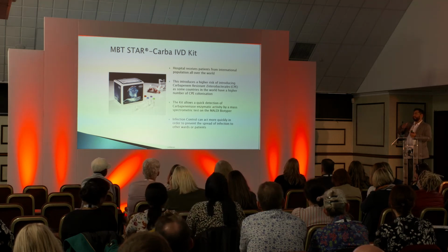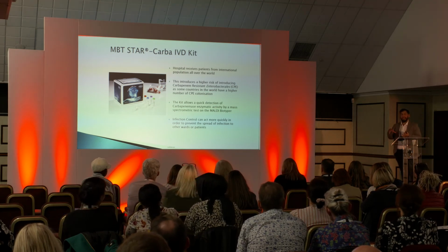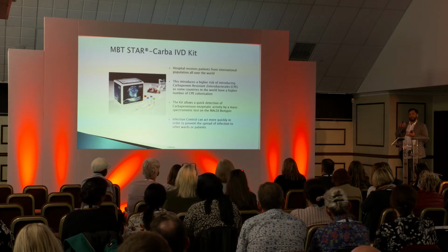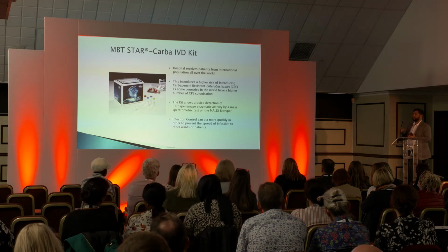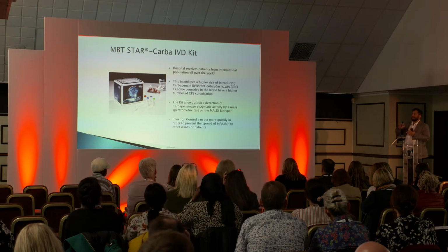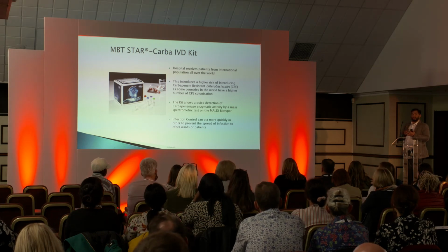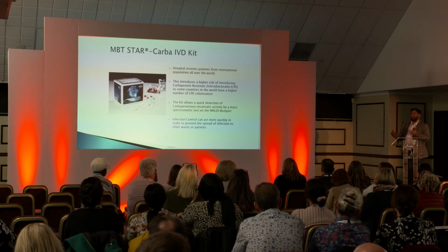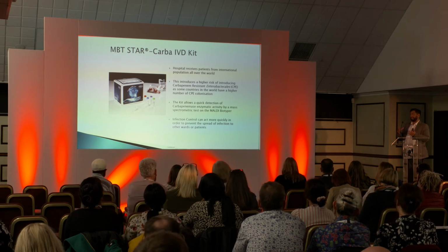So again, the way that we work things up, in our laboratory we do our ID and culture, and we do antibiotic sensitivity by what's called disk diffusion testing, which is another 18 to 24 hours. But using this method, we're working at the validation at the moment, we're hoping to reduce that even more greatly so we can know that result more quickly. That's more so for infection control, so that in terms of managing a patient and stopping transmission to other patients, they can do that.